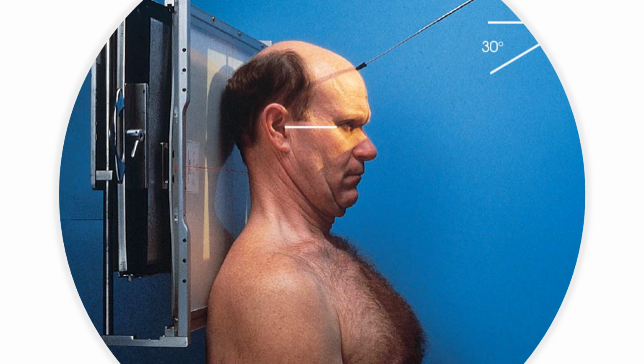Okay? So think about the sella turcica, which is just superior to the EAM. The sella turcica should be on the line of the central ray, and the foramen magnum should be on or just below the line of the central ray, but the line that passes through where you think the foramen magnum is and where you think the sella turcica is should be running parallel to your central ray.